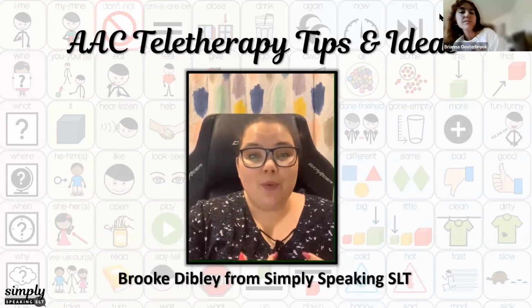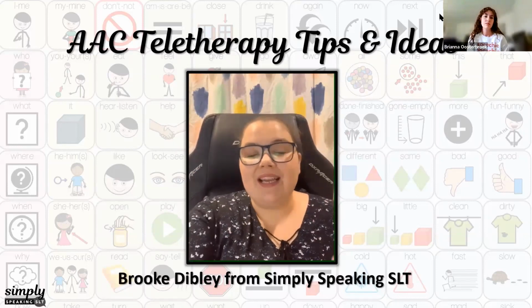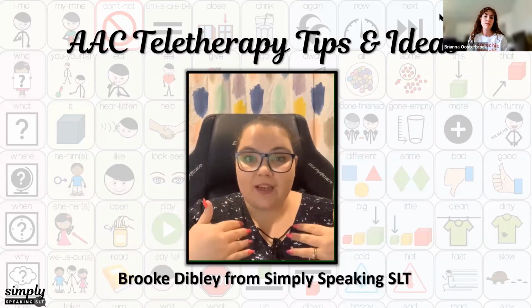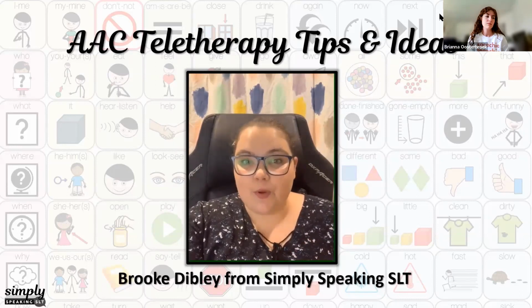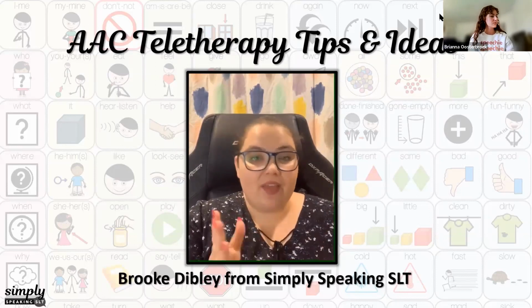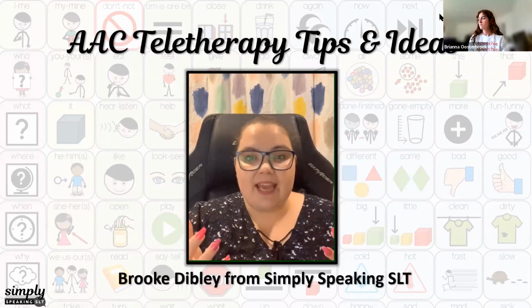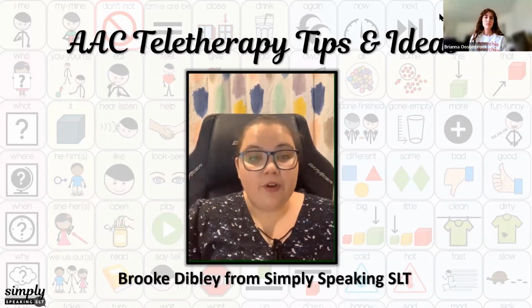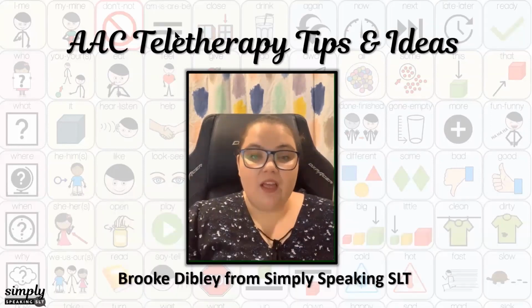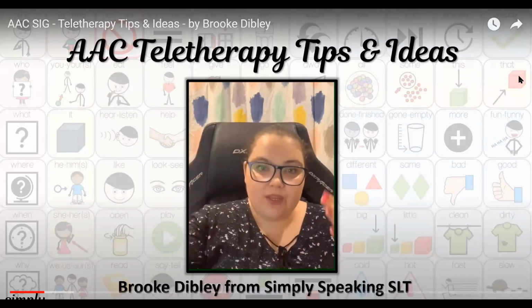And so today I'm going to be covering a few tips and ideas for modeling AAC. And when it comes to having your student show you their productions on AAC, I'm not going to talk so much about that because every student's different. It depends on the system they're using and the resources at their disposal. Hopefully an adult, if they are a child, is with them, or someone who can help facilitate showing you what they are producing. An idea would be maybe a parent or caregiver joins the Zoom on their phone, so that their phone is like the third person. Make sure they mute everything so you don't get that annoying echo.